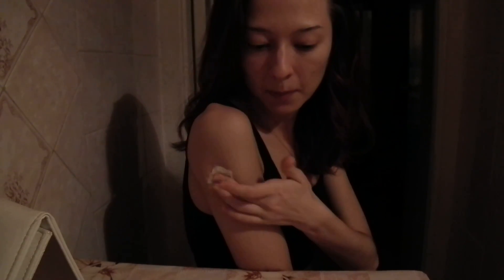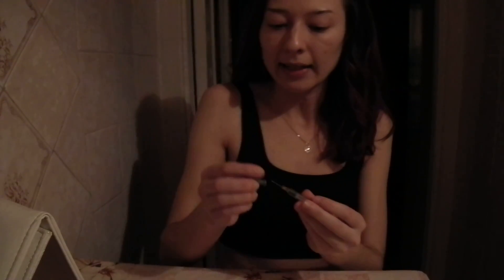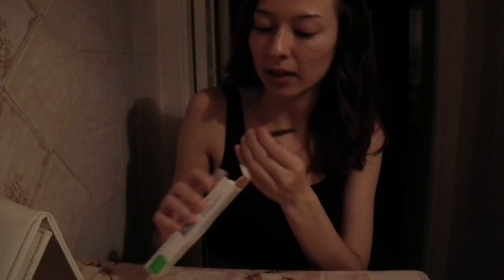And you're done — one flu vaccination. Get rid of the syringe. Take it to a nurse and she'll get rid of it for you — take it to a clinic. But dispose of it properly.